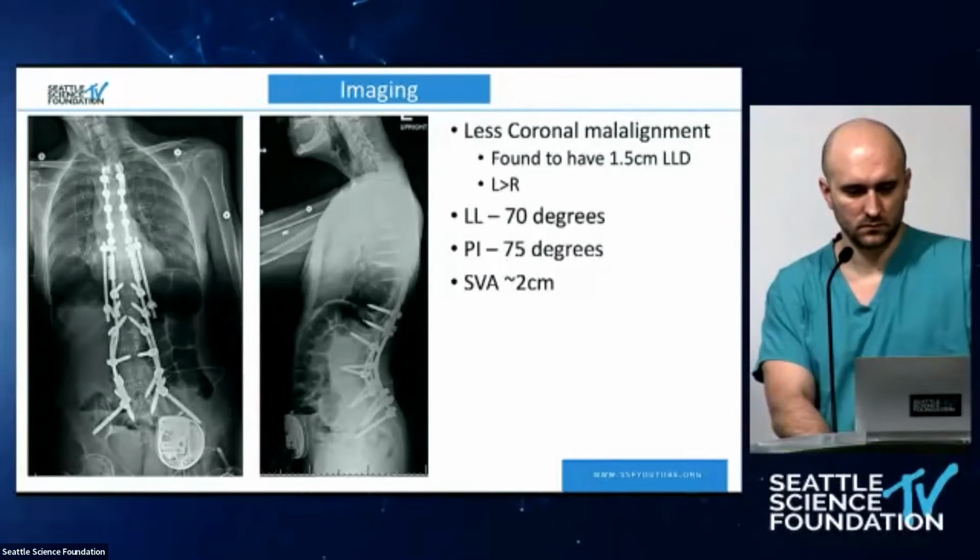Yeah, I think Bob did a great correction here. I always have a hard time with PSOs because it's hard to assess your correction intraoperatively. Sometimes you want to do more and you get less, sometimes you get more and you want to do less. They don't always go as planned, but this looks beautiful.